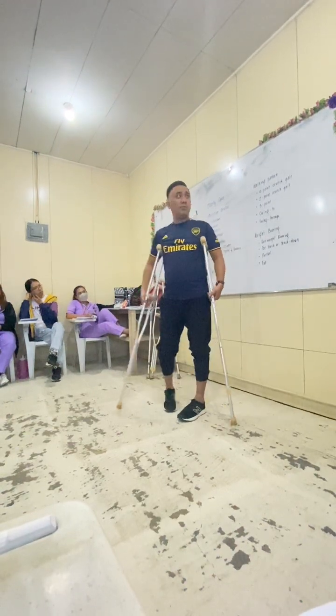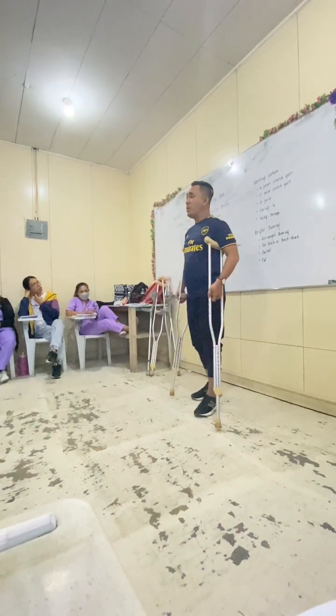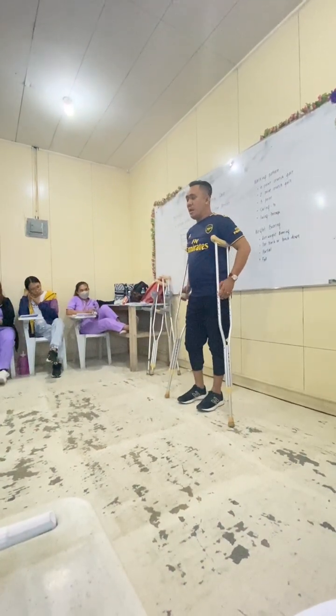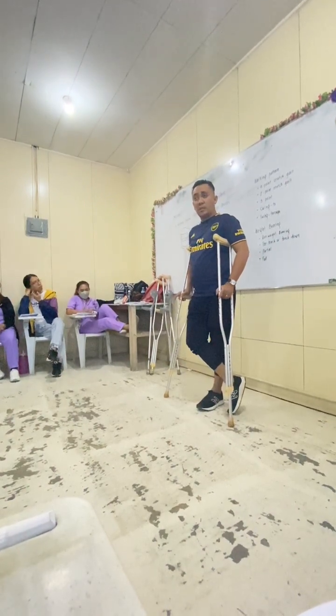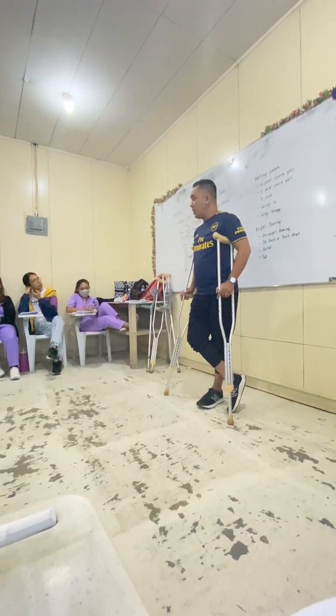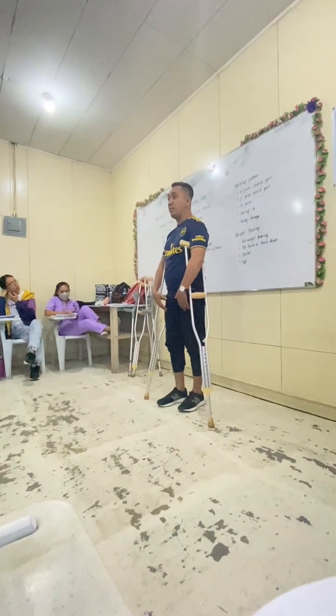So let's start off with the 4-point crutch gait. 4-point crutch gait is the first crutch gait na matulog ni patient if bago pa siya nagsugod ng gamit sa axillary crutch. And both legs is okay ra. Weak leg, that's the problem.